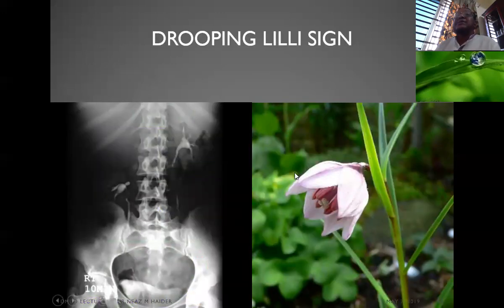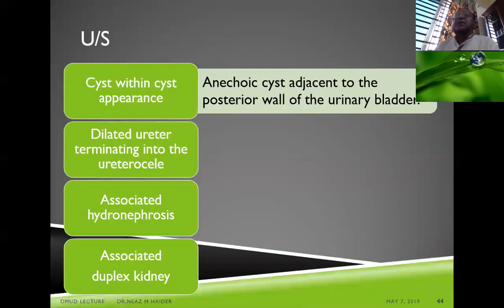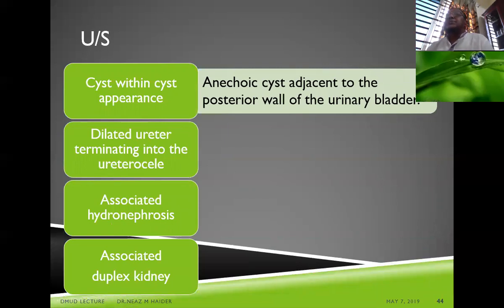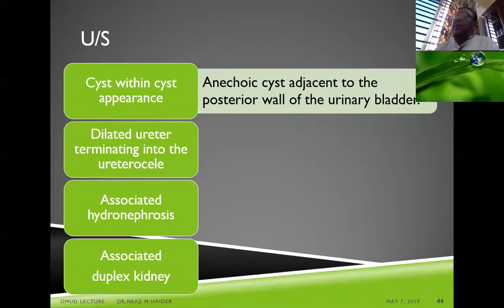The drooping lily sign is associated with duplex kidney and ureterocele — the lower moiety droops downward due to the non-functioning obstructed upper moiety. On ultrasound, a cyst-within-a-cyst appearance is seen, with the dilated ureter draining into the ureterocele. Associated hydronephrosis and duplex kidney can be identified by detecting a bifid renal sinus.